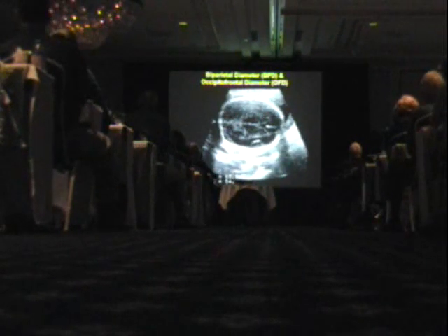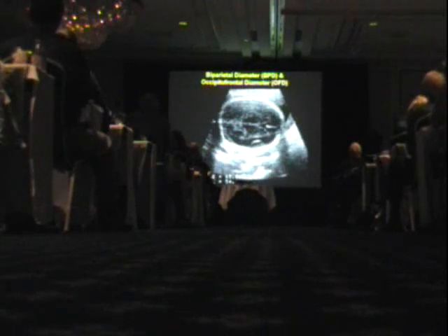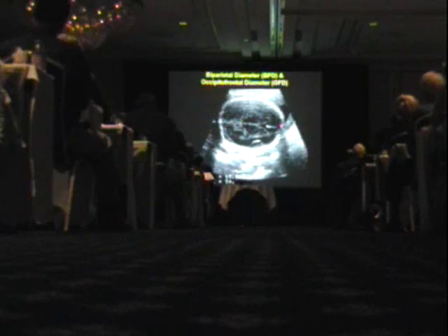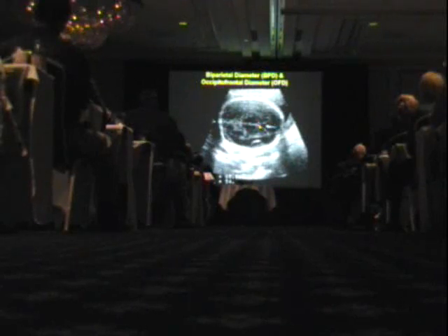In the second and third trimester, our primary measurement for age determination is our measurements of the fetal head, which on the standard plane that you'll read about, you'll see the midline echoes, and the midline is symmetric between the two sides, the hypoechoic thalami, the cavum septum pellucidum seen here in the classic description. And then we measure leading edge to leading edge for biparietal diameter and mid-skull to mid-skull for the occipitofrontal diameter.